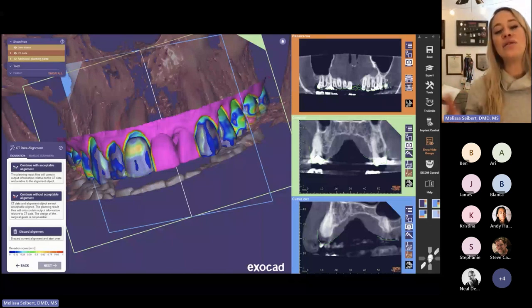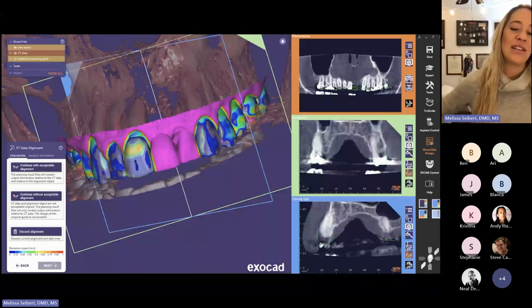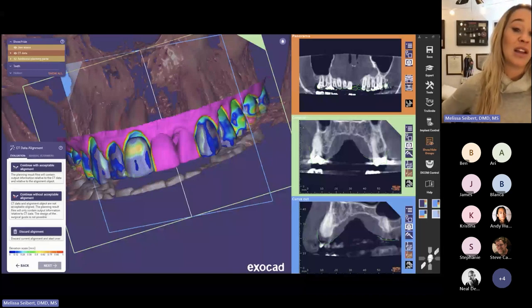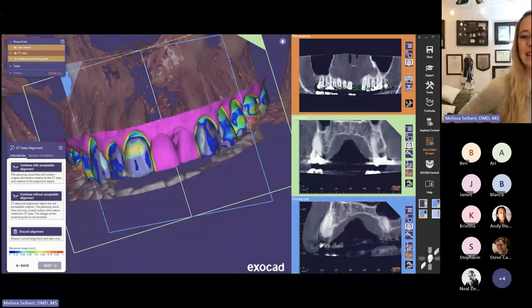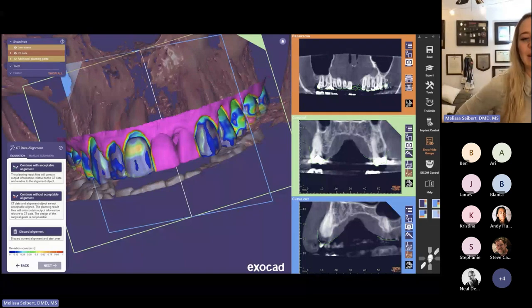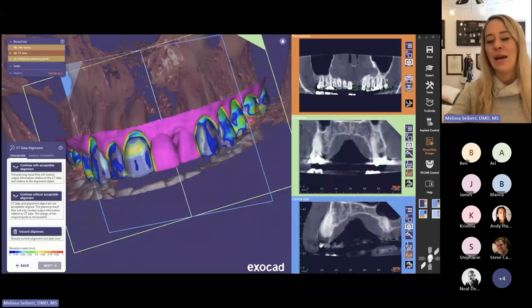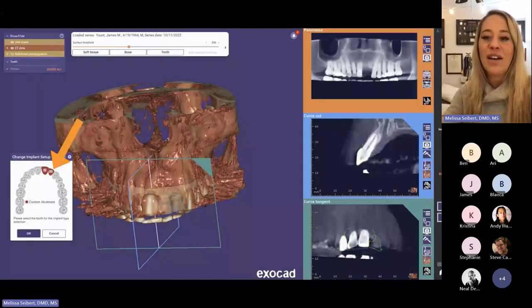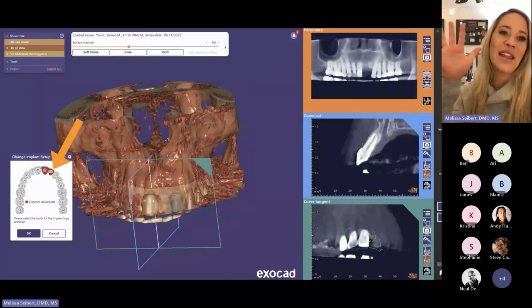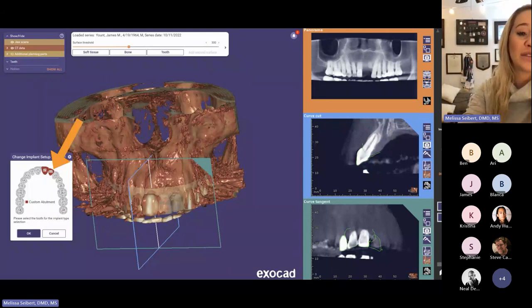One reason guides might not fit is that you're not properly overlaying the design with the patient's arch and the CBCT. With ExoPlan — and I've used other softwares — I find that it gives me a heat map telling me exactly where I'm deficient and where I need to make adjustments. What's highlighted in magenta is going to be the design. That new design is not going to be on the CBCT because it doesn't exist yet, and soft tissue won't overlay the CBCT, but we want the hard tissue to overlay. With this software, I'm getting live feedback for the adjustments I need to make. I can toggle through different layers and adjust the threshold to make overlaying as easy as possible.